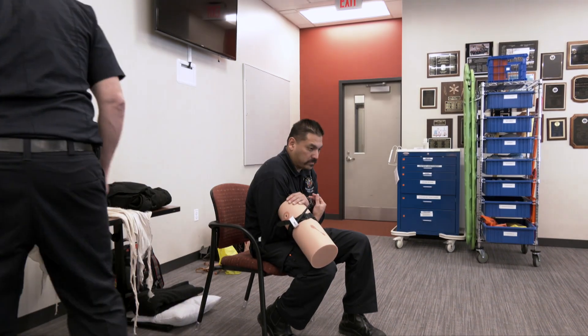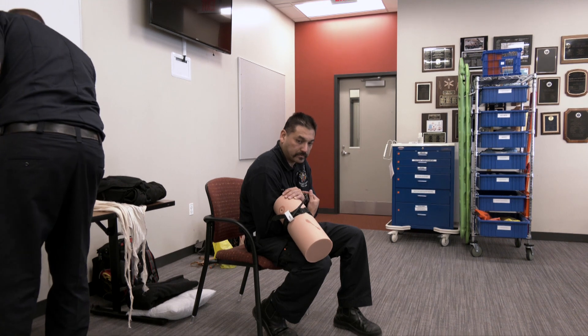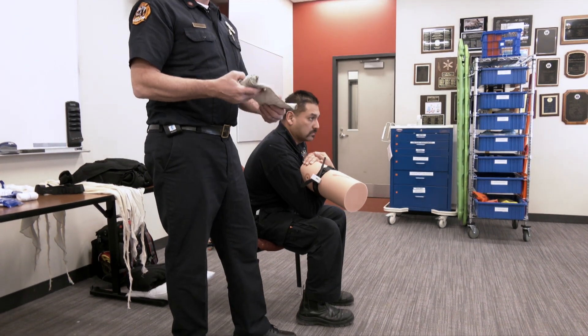Now let's talk about the pressure dressing. We can use the Israeli bandage for that — it's designed specifically for that purpose. There are several ways to put this thing on; I've seen it applied no less than six different ways.